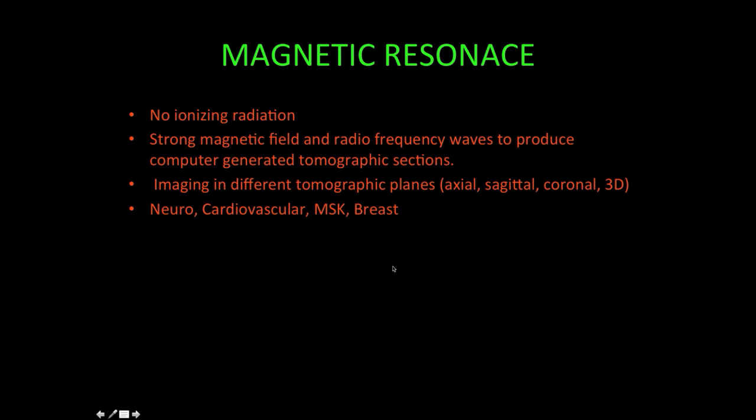It is excellent in the neurological system: brain, CNS, spine. Excellent for cardiovascular imaging, musculoskeletal imaging, and recently has become incredibly useful in breast imaging, particularly in breasts that are very dense. It is somewhat limited in evaluating the lung parenchyma.